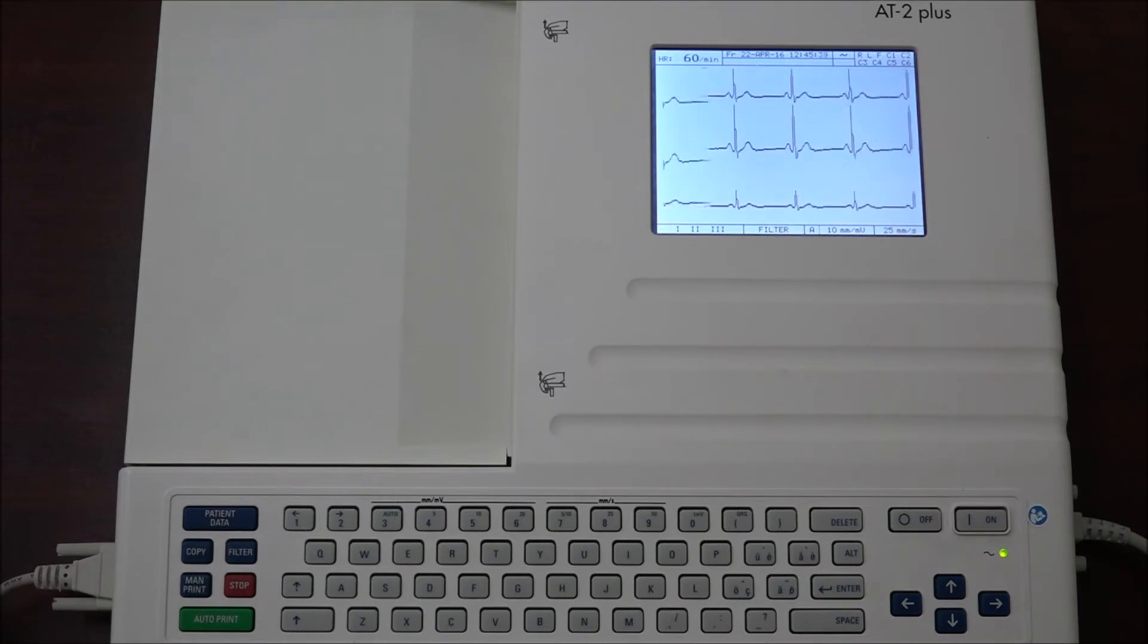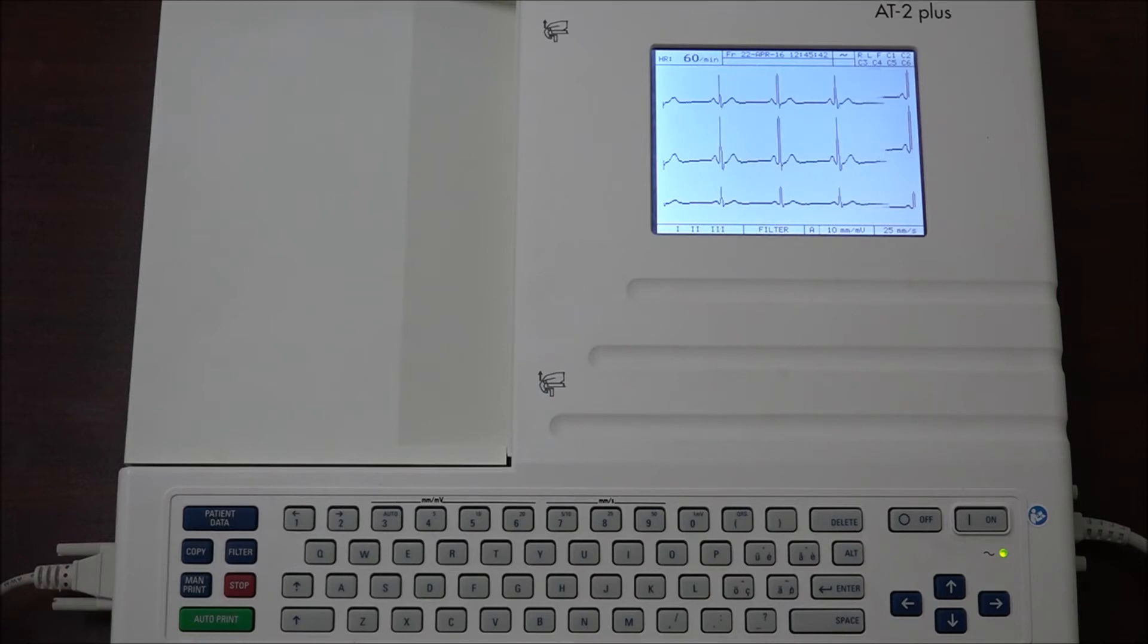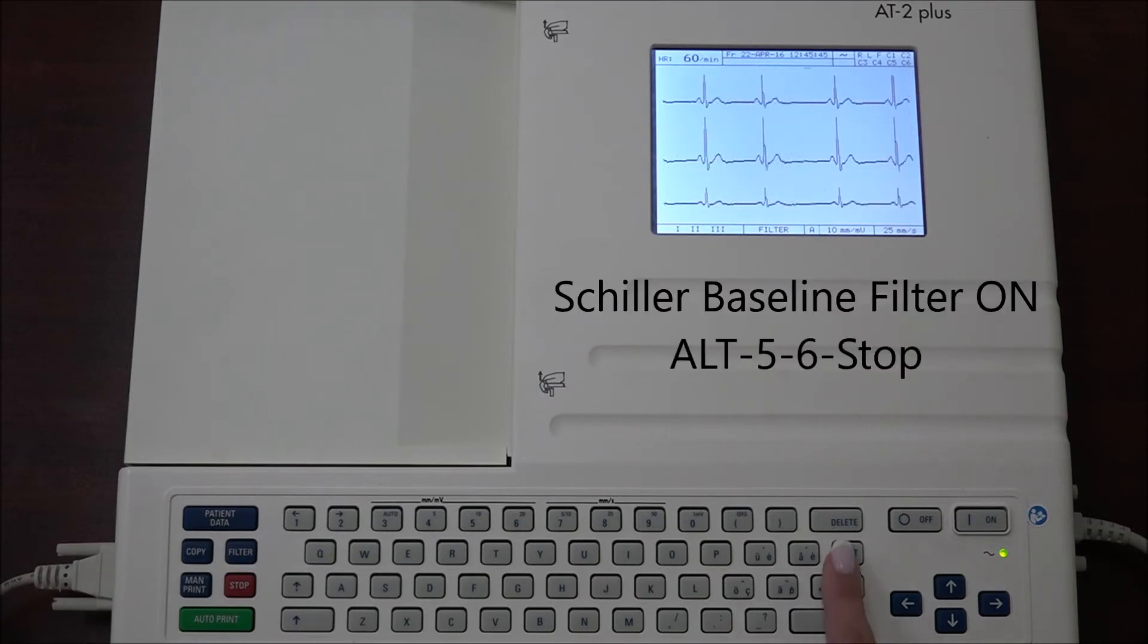The smoothing filter in Schiller baseline filter can be activated or deactivated. To turn the Schiller baseline filter on, press ALT 5 6 stop.